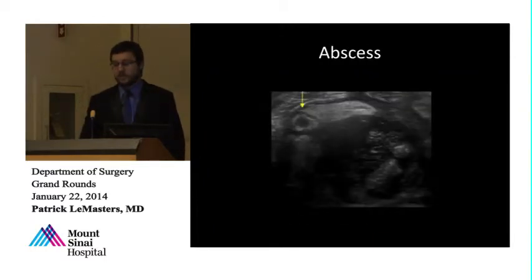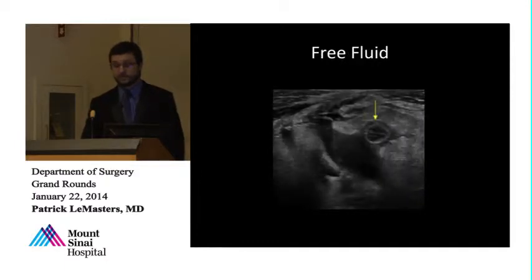What else can you look for? You can look for abscess. Here's a patient with appendicitis with a large periappendiceal abscess. You can look for free fluid. Here's a large amount of free fluid next to the appendix in a patient with perforated appendicitis.